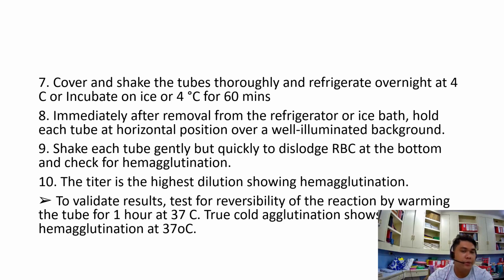Okay, so regarding the procedure for cold agglutinin, you need 7 test tubes.